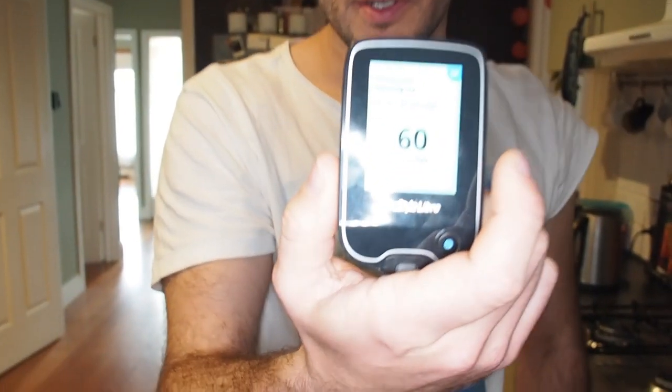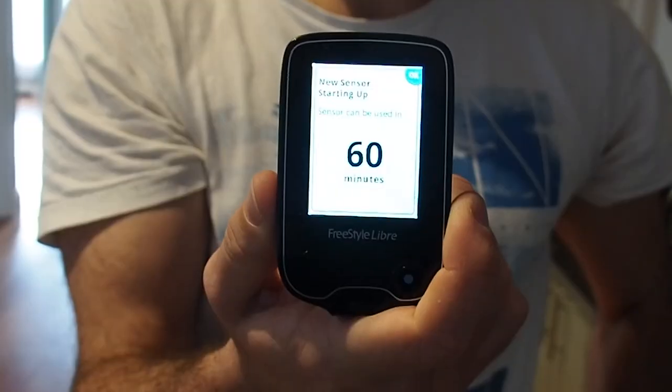New sensor found. To calibrate, it's going to take 60 minutes. You can see all the dots in the line. Cool.